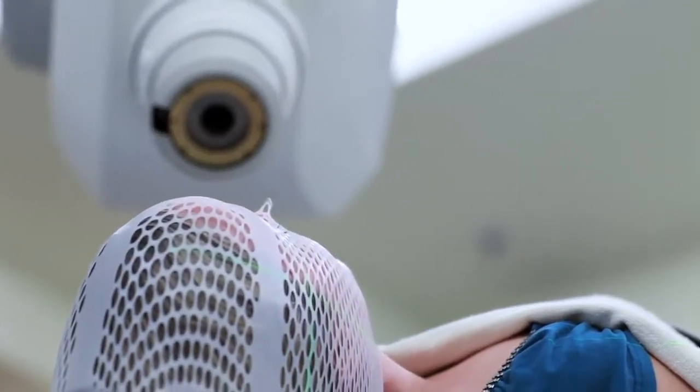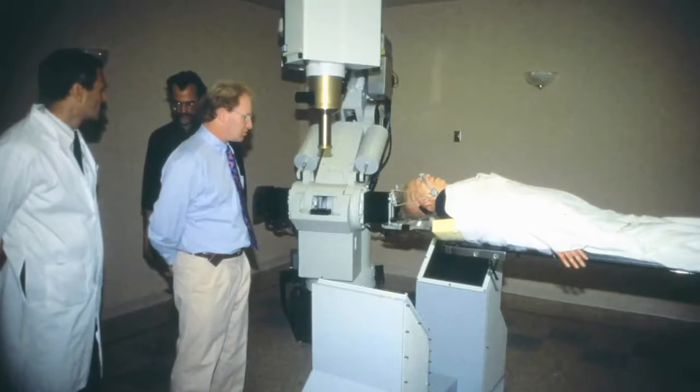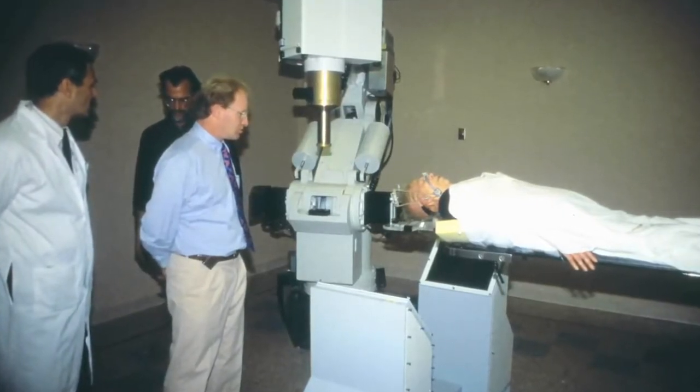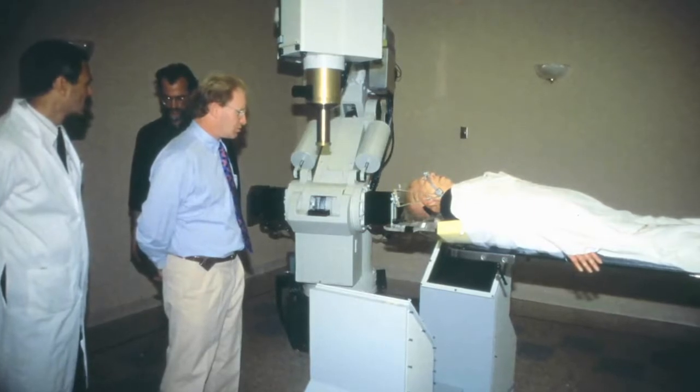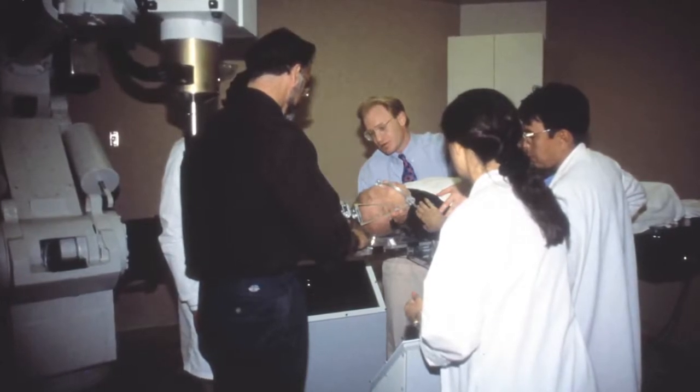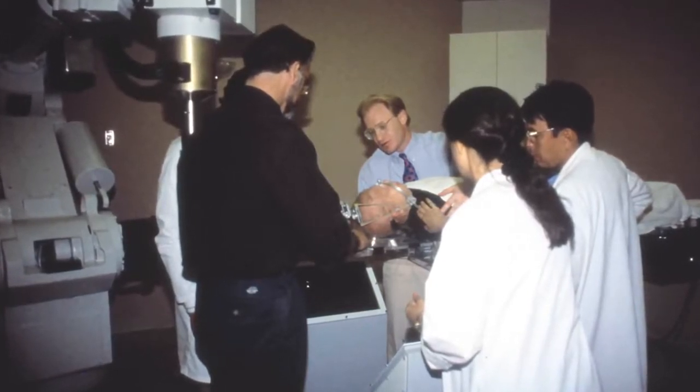The CyberKnife was invented at Stanford by John Adler. John studied with Lars Lexell in Sweden who introduced the invention of the Gamma Knife to neurosurgery. I was in Stockholm and caught up under the spell of Lars Lexell. And it seemed to me that Lexell was describing the future of much of neurosurgery. And I just couldn't get it out of my head.